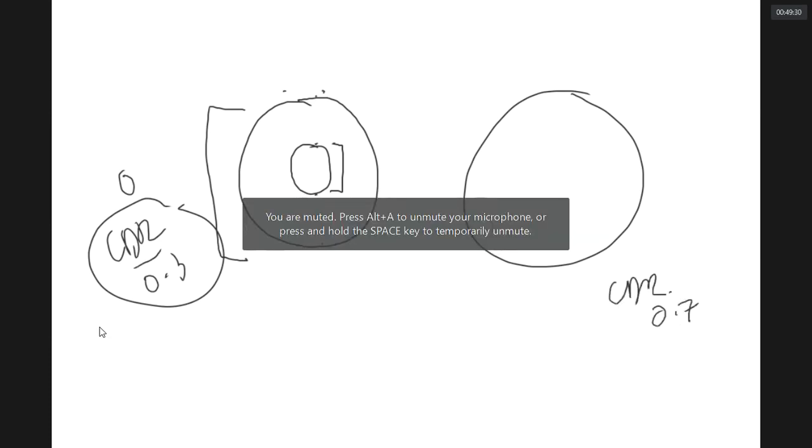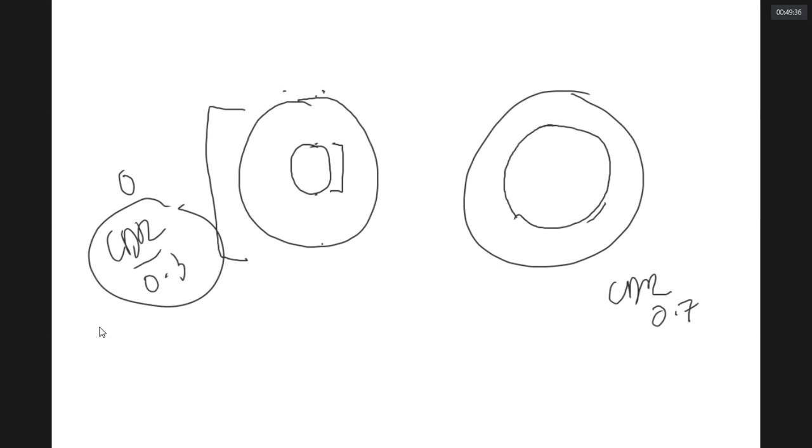Okay, but let's say we are talking about a CDR of 0.7. Usually we have to draw the inner cup slightly bigger to indicate that this is a cup disc ratio. But as for the colors, usually I just use black. I think there is not really a code for it. It's just the shape of the disc.